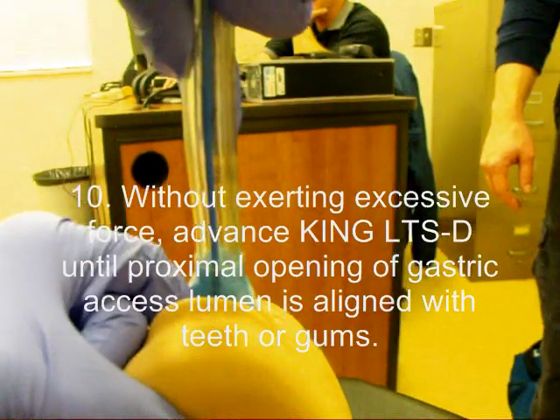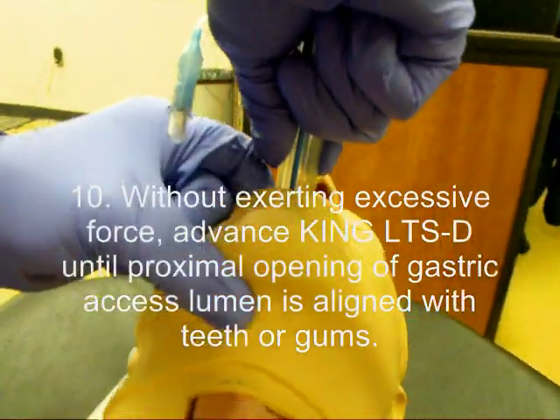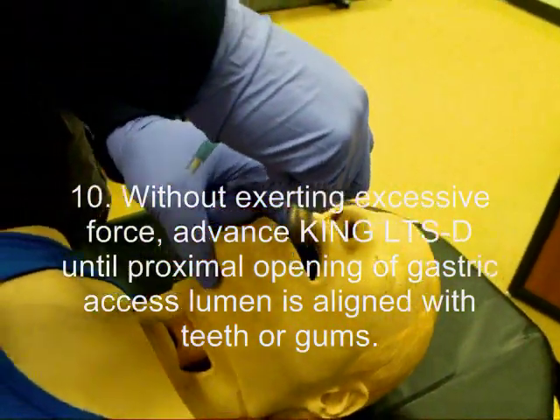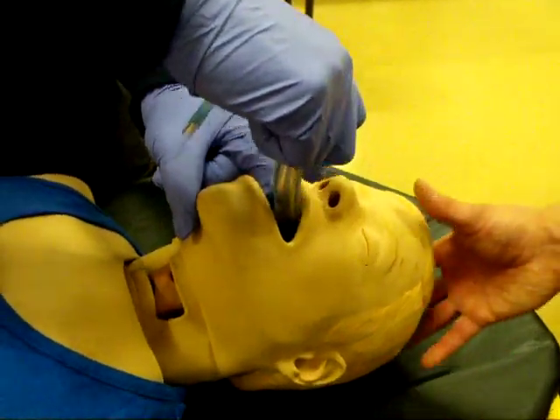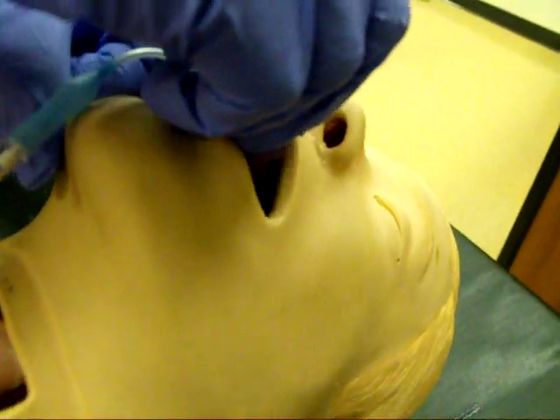Without exerting excessive force, advance the airway until the proximal opening of the gastric access lumen is aligned with the teeth or the gums. This would be the color-coded connector. The bottom of the color-coded connector should be even with the teeth or gum line.